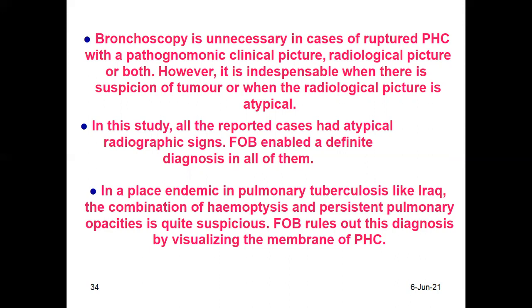In a place endemic in pulmonary tuberculosis like Iraq, the combination of hemoptysis and persistent pulmonary opacities is quite suspicious. Fiberoptic bronchoscopy rules out this diagnosis by visualizing the membrane of pulmonary hydatid cyst.